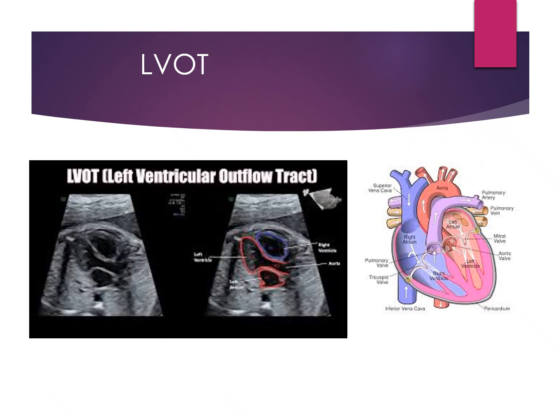And then the next one is the left ventricle outflow tract. If you are thinking about the anatomy of the heart in a pediatric patient, we know that the left ventricle will flow out into the aorta. I've got a picture here. The left ventricle opens up to the aorta, and then it comes down to the descending aorta and through the rest of the body. So cutting this image, we're going to see our left ventricle, and then the aorta coming out of it in long axis.